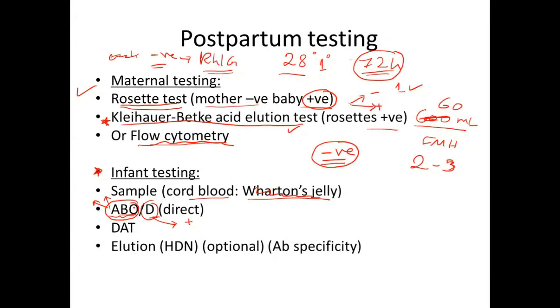Okay, so because the antibody, we don't expect the infants to produce anti-A and anti-B, and even if we find them, they usually come from the mother. Okay, if we suspect the mother developed antibodies, we suspect hemolytic disease of the newborn. So we can do that test. Okay, so this is an indicator.